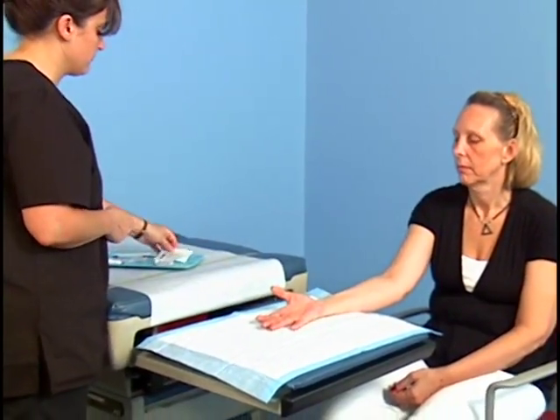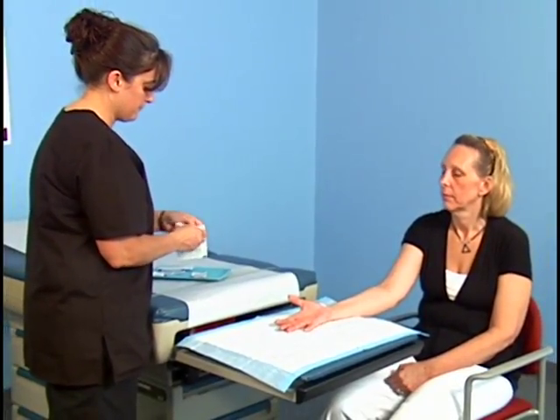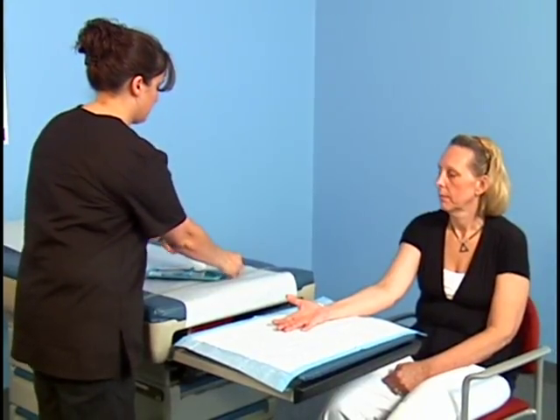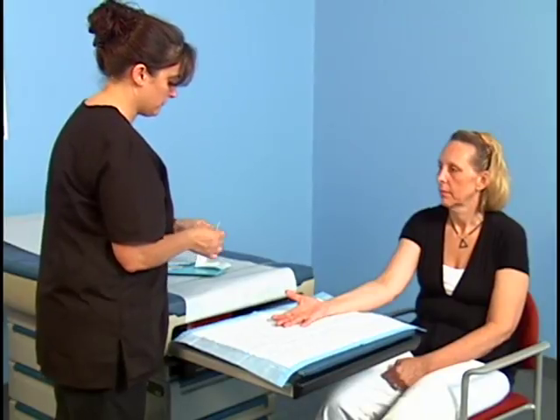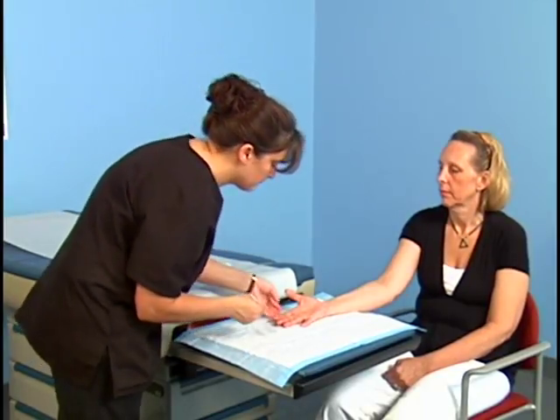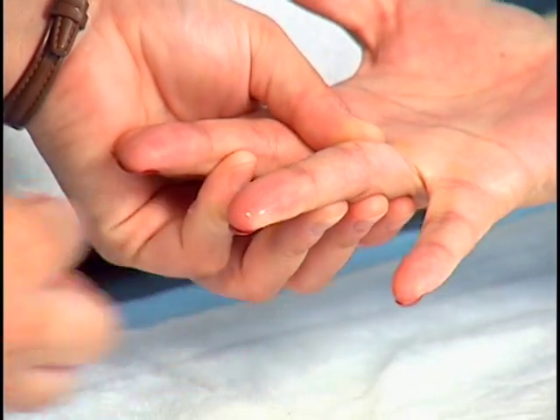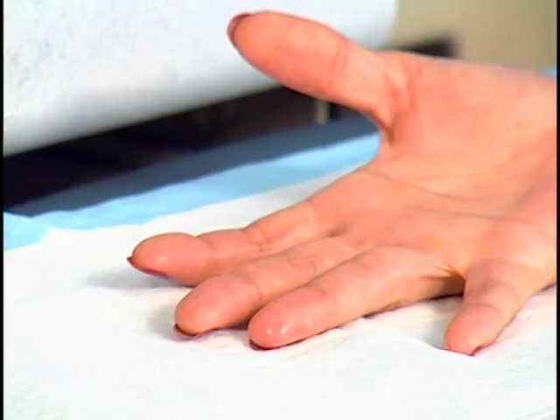Open the sterile gauze pack and lie it flat to allow the gauze pad to rest on the inside of its wrapper. Cleanse the site with an antiseptic wipe. Allow the site to air dry to give the alcohol enough time to destroy the microorganisms on the skin.